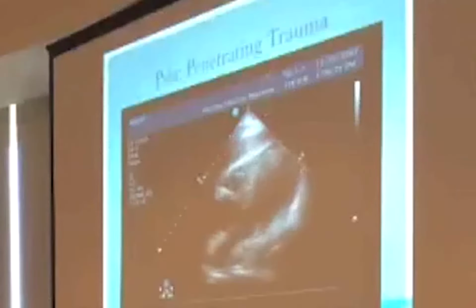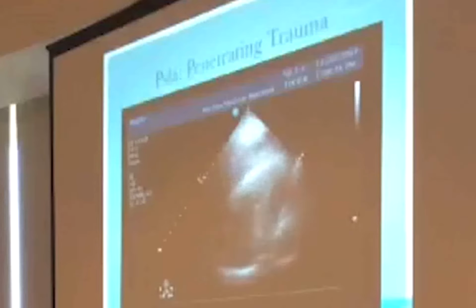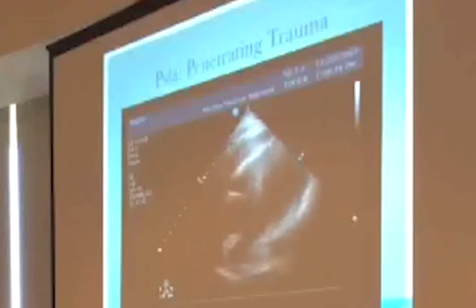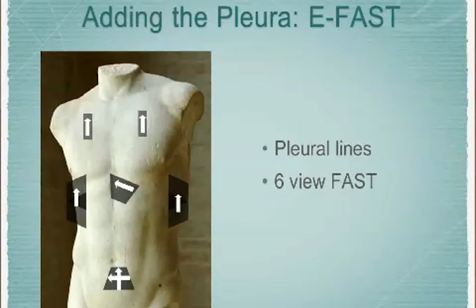You can kind of think, well, this is the right ventricle here, and all of this is sort of the left ventricle, and it looks okay. But this is the right ventricle border here. It's being squished. This is not only fresh blood, but clot. So there's a big massive clot there, and we've seen people who have that missed, and missed large effusions like this, and you'll now recognize it again.